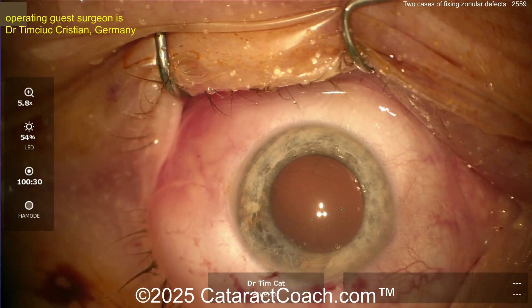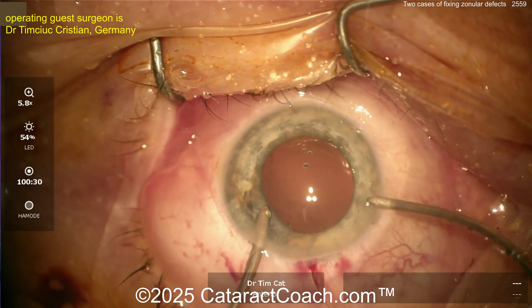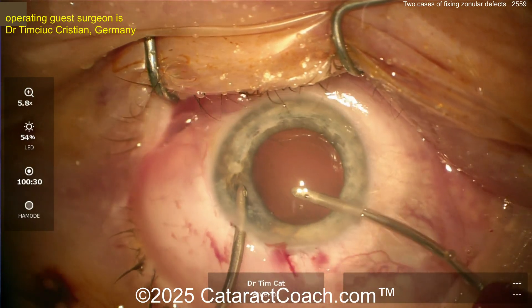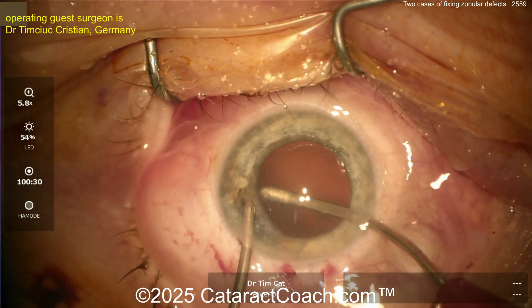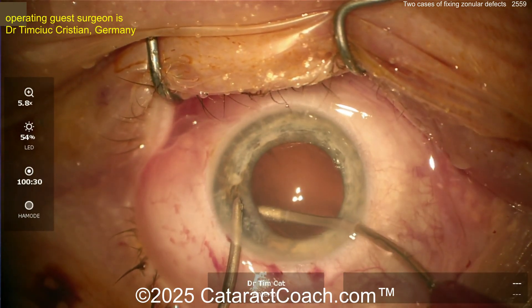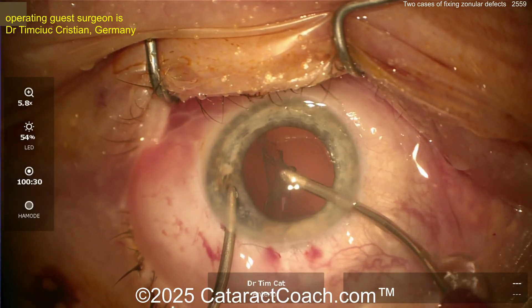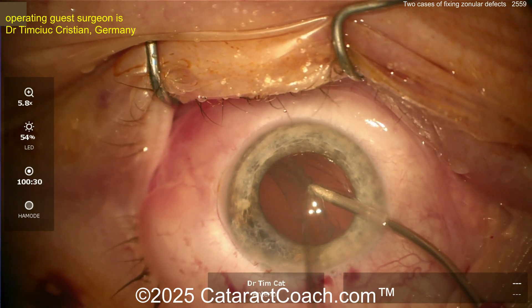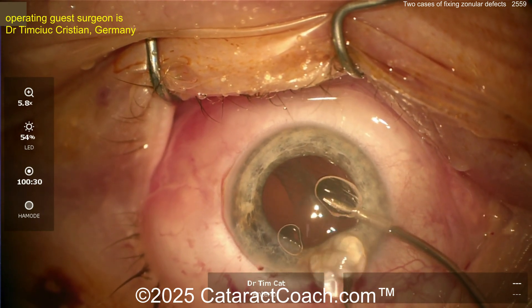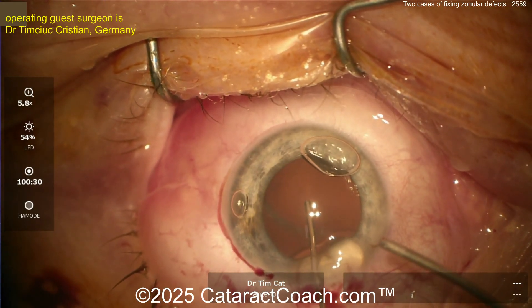Switching over, letting go of that capsule — coming back in. You may have some existing weakness here, so be cautious getting the cortex out. If it's very adherent, don't pull too much — let the vacuum go. That's a lot of pulling. So now you've got probably four or five clock hours of zonular loss.